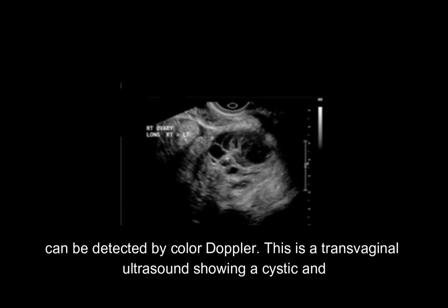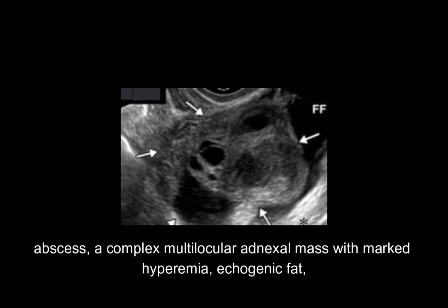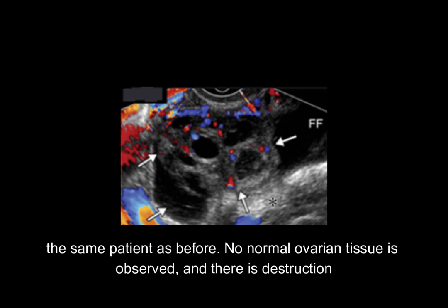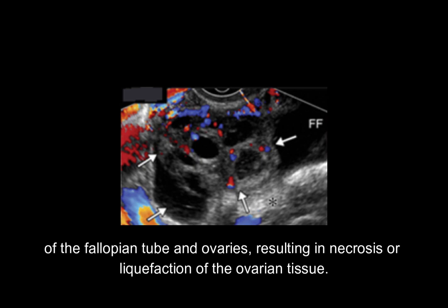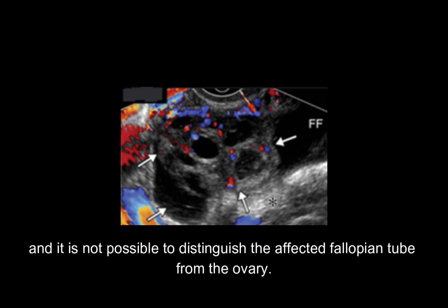This transvaginal ultrasound shows a cystic and solid mass with septa, indicating a tubo-ovarian abscess. In this grayscale image, a complex multilocular adnexal mass with marked hyperemia, echogenic fat, and free fluid are present. This follow-up transvaginal ultrasound with color Doppler of the same patient shows no normal ovarian tissue. There is destruction of the fallopian tube and ovaries, resulting in necrosis or liquefaction of the ovarian tissue. The presence of multiple cystic components indicates areas of ovarian necrosis, and it is not possible to distinguish the affected fallopian tube from the ovary.